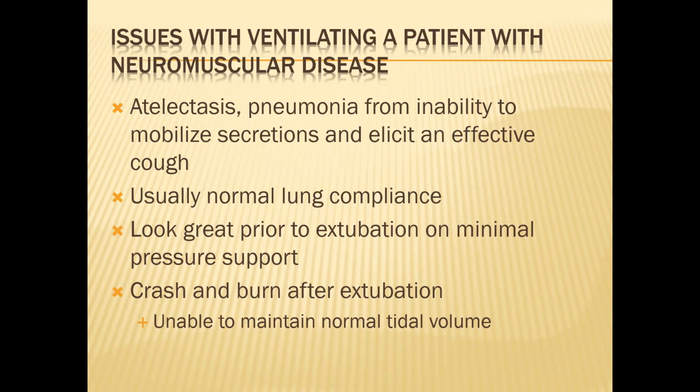High flow doesn't help much with the size of the tidal volume. So I don't know if high flow would help them. Yeah, so if they need pressure support to get a normal tidal volume, that would be BiPAP.